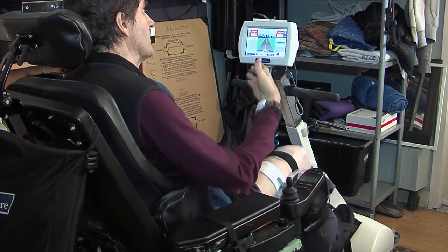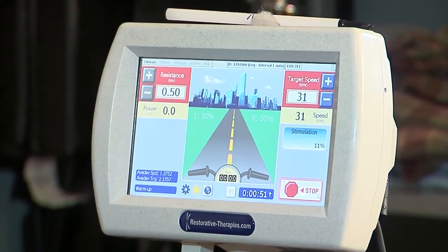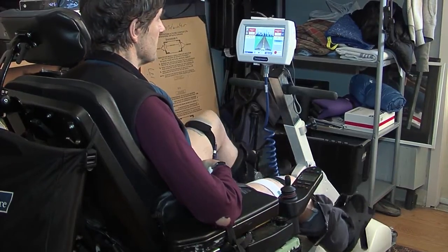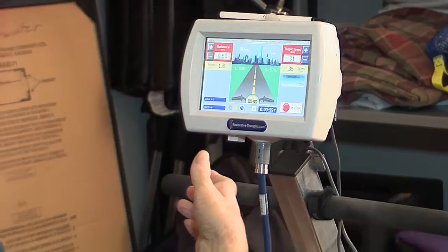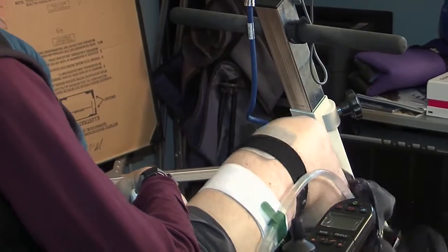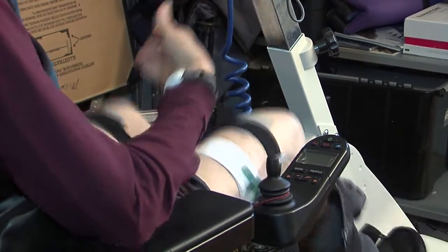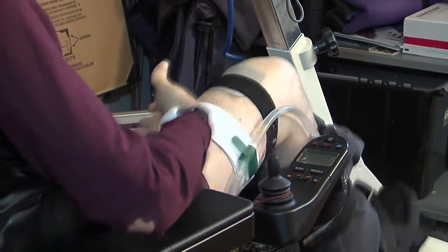At this point the RPM is slowly increasing up towards 30 RPM, and this will continue for the warm-up period, which I've set to one minute. Now we're entering the active phase where the machine is starting to supply electrical stimulation to my muscles, which will show on the right side of the screen.